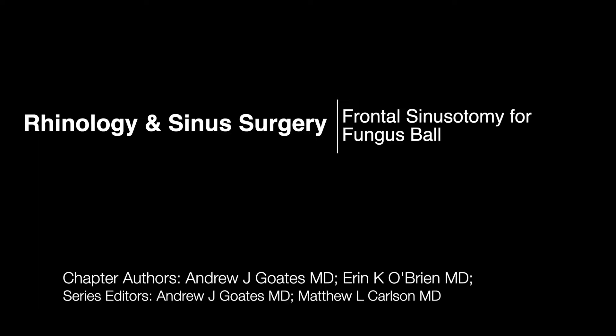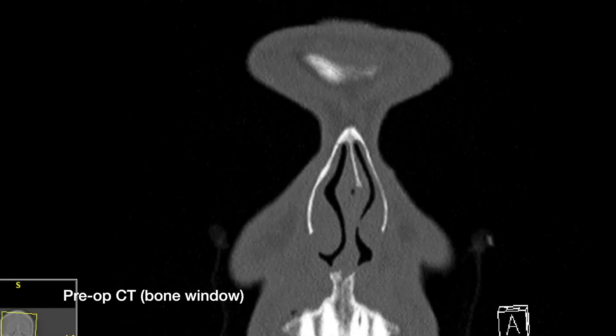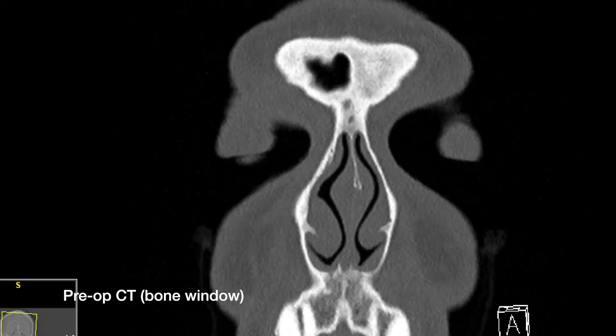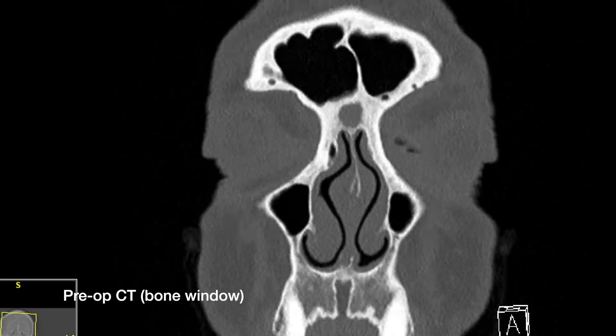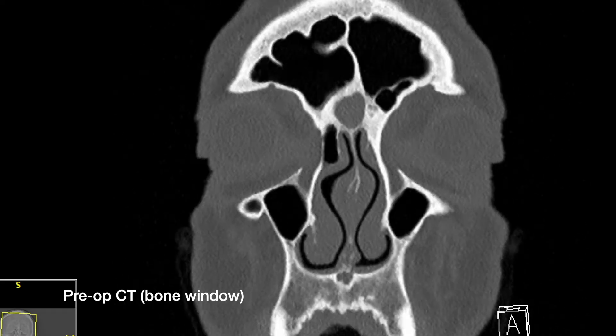This is a 71-year-old male with a history of nine months of frontal headaches, which initially improved with antibiotics, but he had persistent disease, and a CT scan was obtained. This demonstrated no significant sinonasal mucosal disease.